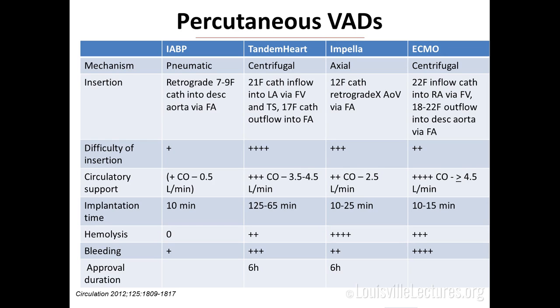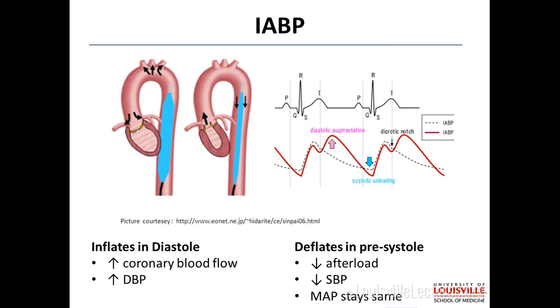The cardiac surgeon will. It's full cardiac output support. So what do each of these look like, and what are the pluses and minuses? Who has ever had a patient with a balloon pump? Anyone taking care of a balloon pump? Okay, so some of you.